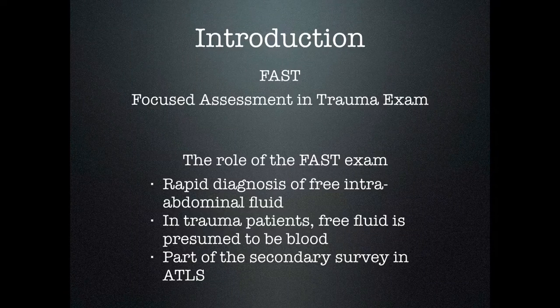This is also part of the secondary survey in ATLS. Clinicians who use ultrasound in their daily practice can use the FAST exam not only for trauma, but for many other indications. However, we will focus on the trauma applications in this lecture.